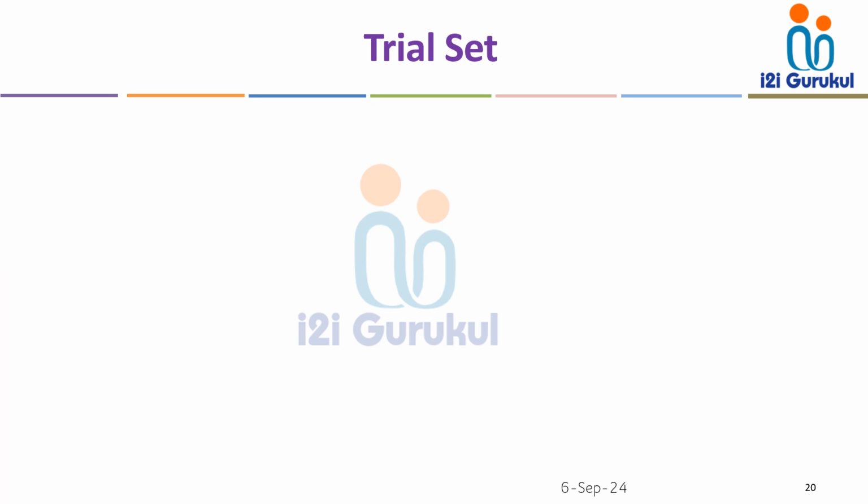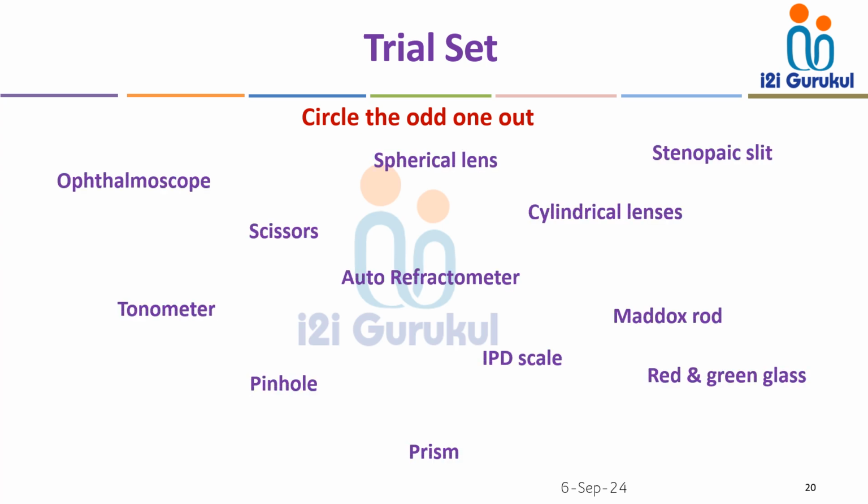Coming to the small activity here, we have seen all the contents of the trial set. So you can circle the odd one out. As I mentioned in the earlier slides, we have spherical lenses in the trial set, stenopaeic slit and accessories, cylindrical lenses are there, autorefractometer is not there, and scissors are also not there in the trial set.